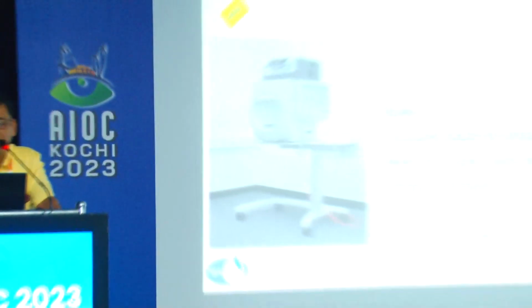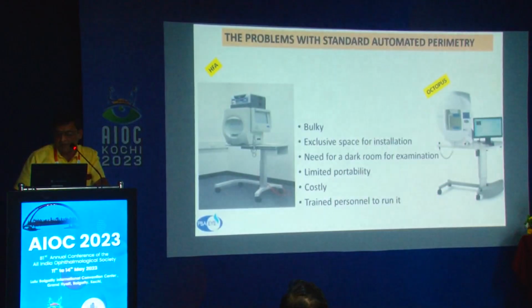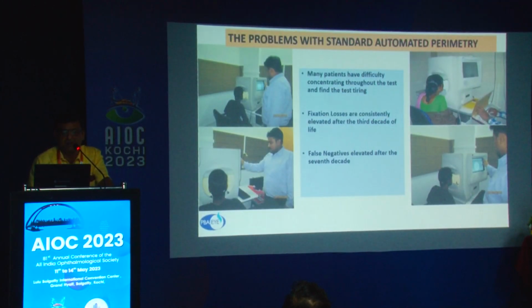Thank you, Arijit, for asking me to be a part of this IC. So I'll be speaking on newer perimetry techniques. So what are the problems with the standard automated perimetry ones which we are used to use for such a long time? They are bulky, they hit a lot of space, they have limited portability, they are costly, and they need trained personnel to run it.